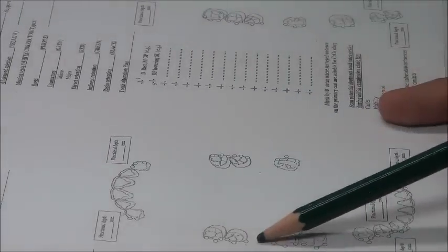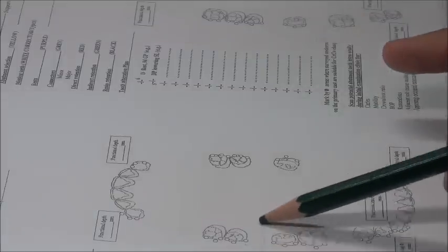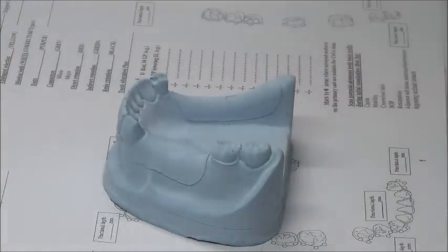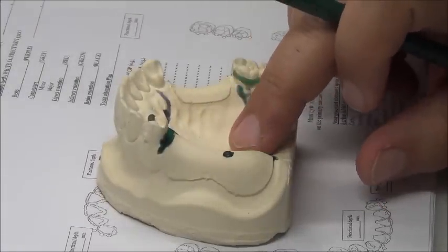We're still on the left, we're on the upper. Where is the junction between the upper and the lower? This is the junction. We are left with the basic design. We said major connector. The best major connector in the lower is? Lingual bar is the best. The upper, what is the best major connector? The palatal strap. This is the best.